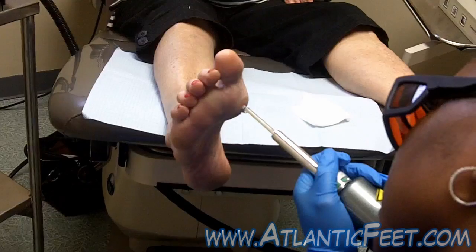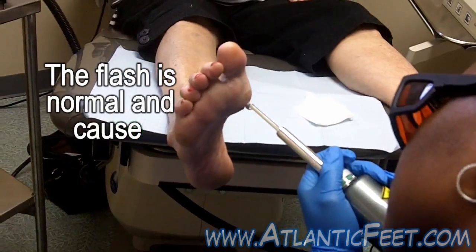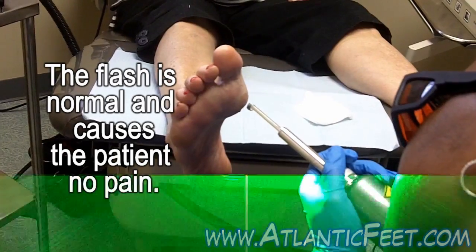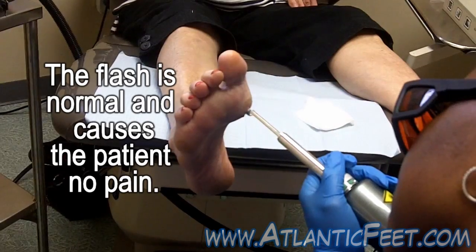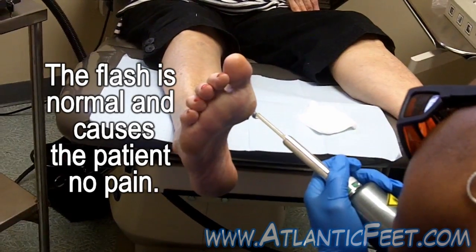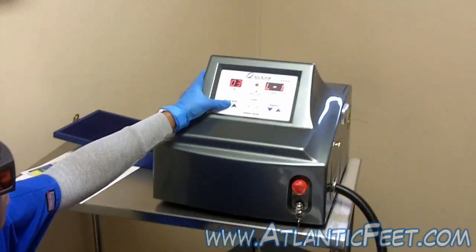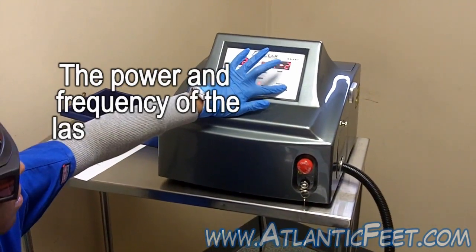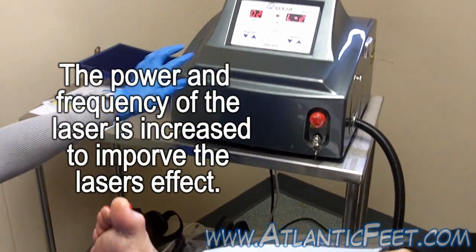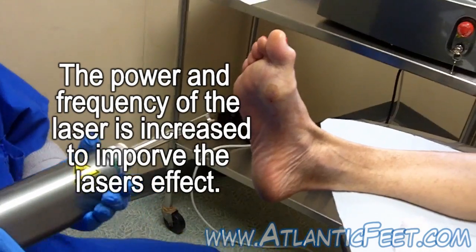Don't worry about the loudness — are you feeling that or did you just kind of jump? Yes. So we're taking it down — to two hertz, level two. I'll hit you one tap, you let me know if you're still good.